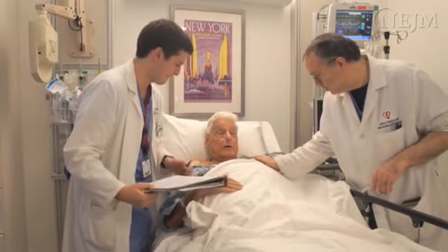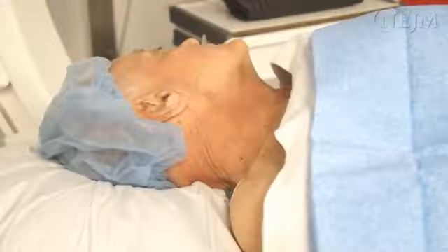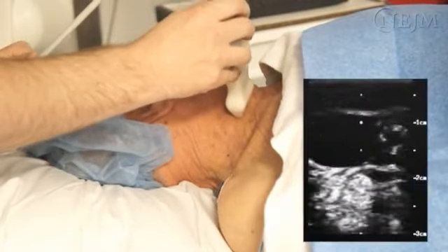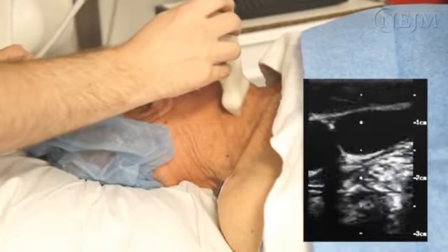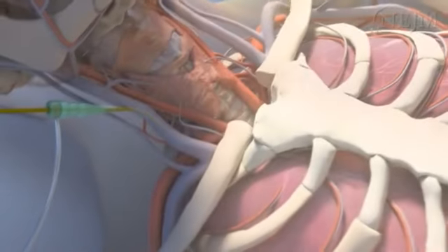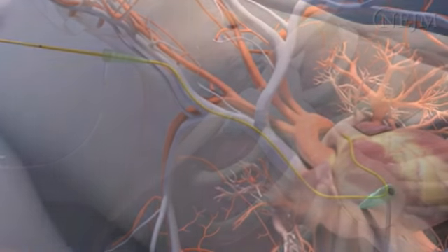After you have obtained informed consent and have reviewed a checklist about the patient and the procedure with the treatment team, place the patient in the supine position. Select a central vein and, if possible, visualize it with ultrasonography to confirm its location and patency. The right internal jugular vein and the left subclavian vein are ideal sites because the curvature of the pulmonary artery catheter facilitates passage through the heart.